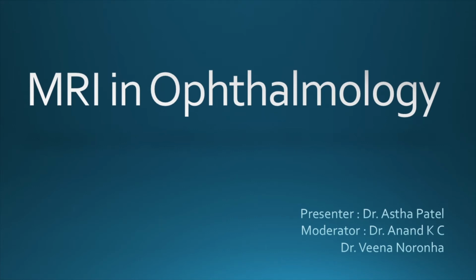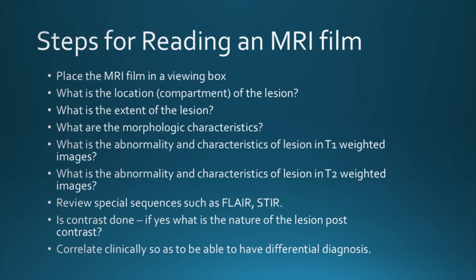Today I'll take the class further in MRI in ophthalmology. Now we'll see in detail how we will read an MRI film to find any pathologies.